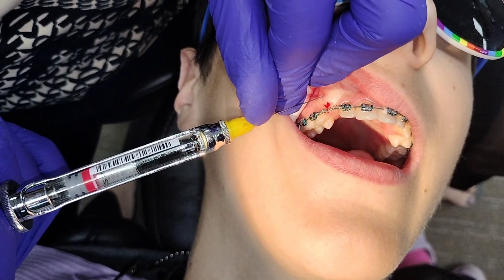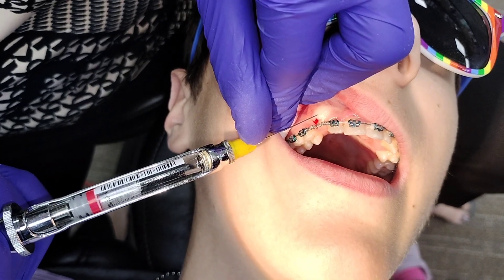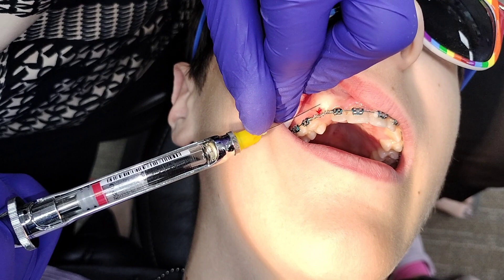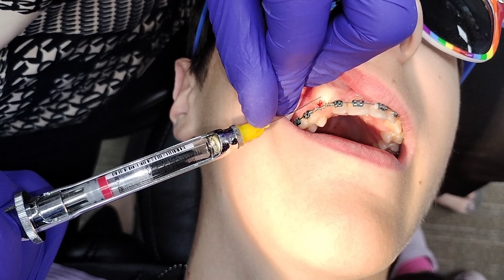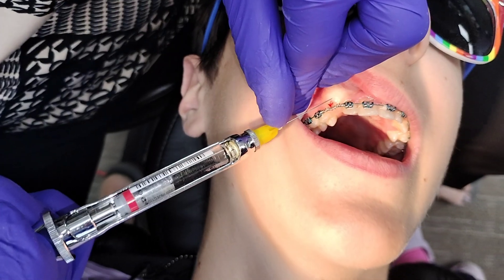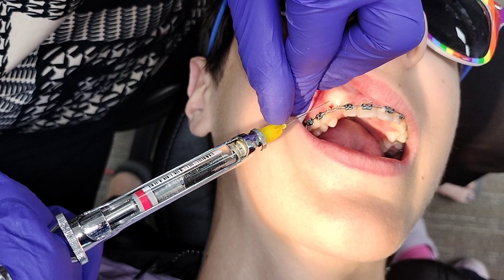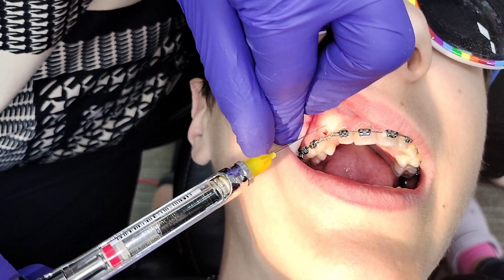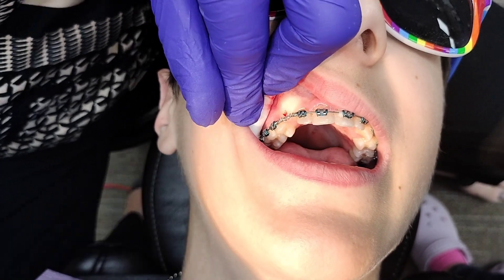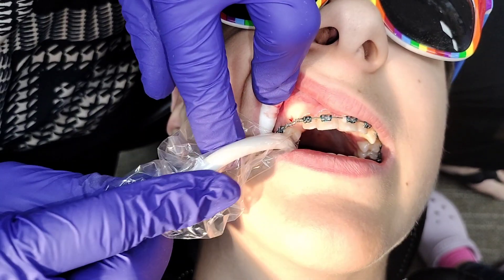I'm going to add a little bit more anesthetic to deal with this cuspid — just a little bit. How are we doing? Okay, it's pressure, I know, a little tight. It's all in the gum tissue. All right, let's have this suction open a bit.